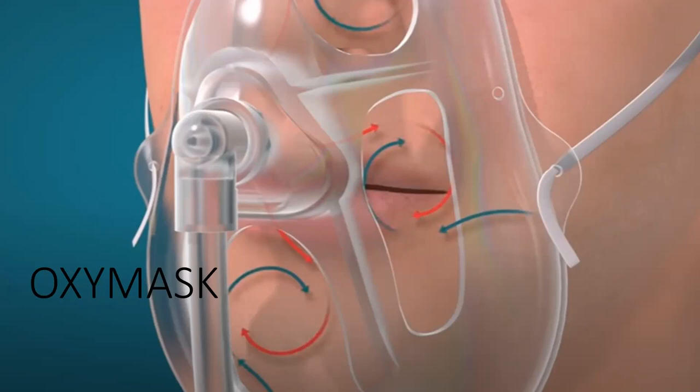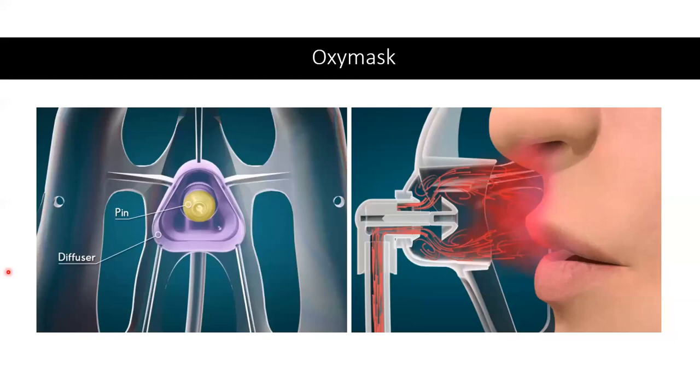Okay, so this is the newest thing. Most hospitals will not stock nasal cannulas anymore, or face masks, or a partial rebreathing mask or a non-rebreathing mask. What is the beauty of this particular device? Well, an oxymask is designed this way, and this is the reason why it is so good, and it is the preferred equipment to store in any particular area of the hospital.